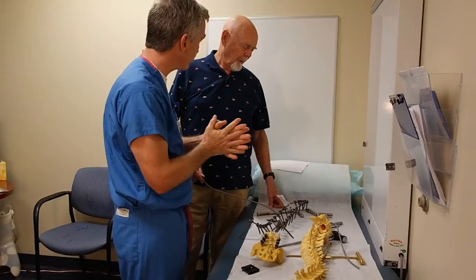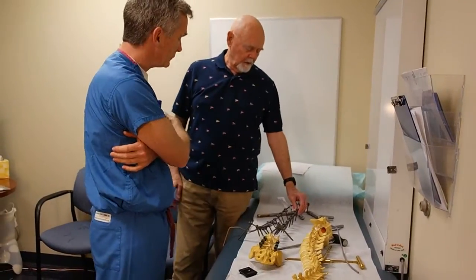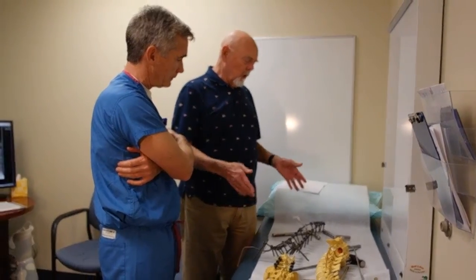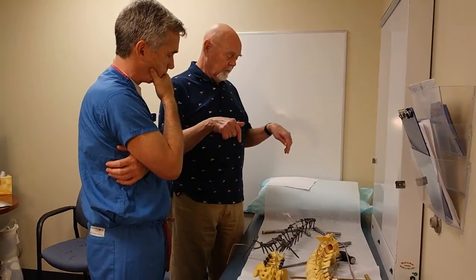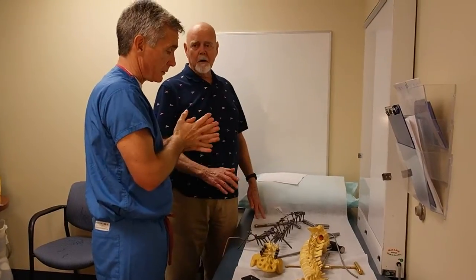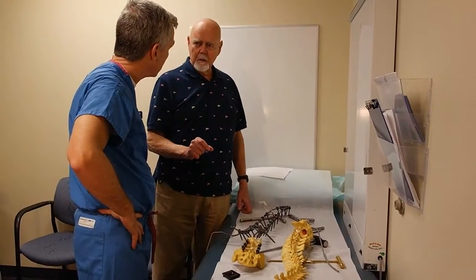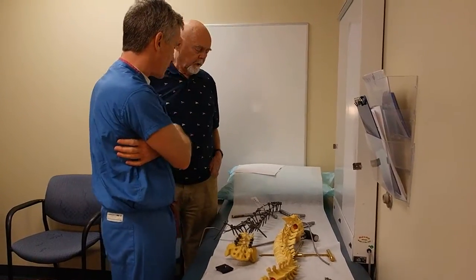It's basically a form of craftsmanship. Thank you for explaining that, because from my junkyard experience, there's no way you can drill holes and have them all come out right. Exactly — especially because the spine isn't perfectly straight at that point. And then you have to adjust those to get the separation right. So in some cases I might put in a little distractor and spread or compress — to move the vertebrae a little bit to help straighten it.